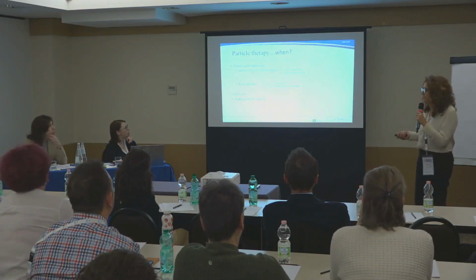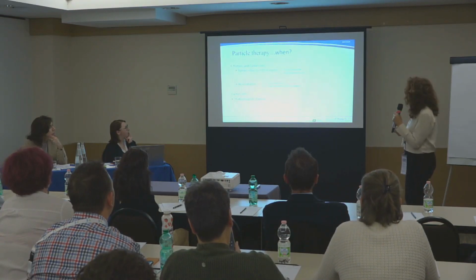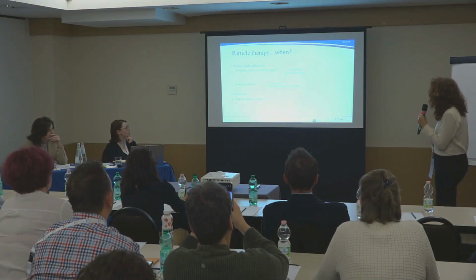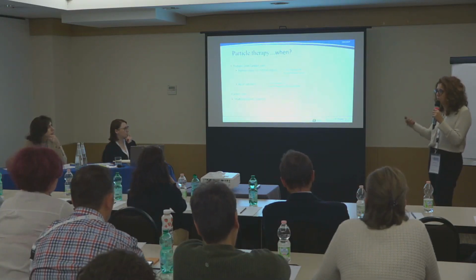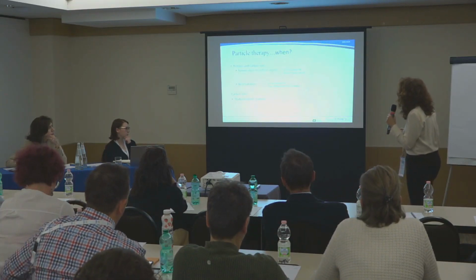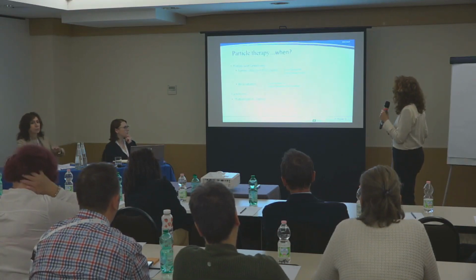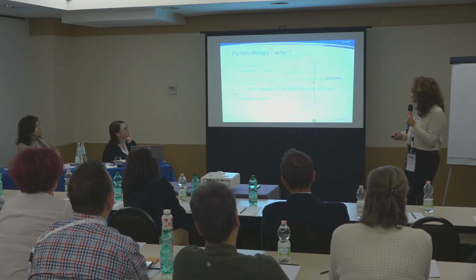We can use particle therapy, proton and carbon ions, for all tumors close to organs at risk, or critical organs, in critical anatomical regions, where it is important not to exceed the dose constraint of the critical organ. The same for re-irradiation, where it is important not to exceed the dose to the healthy tissue, to the tissue already irradiated, particularly carbon ions for radioresistant tumors. So sarcomas respond to all these characteristics.